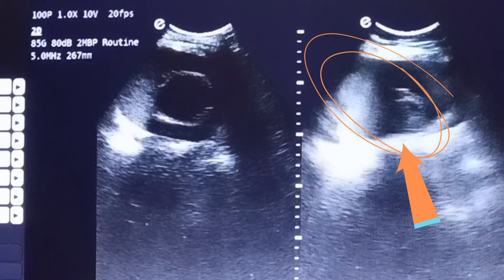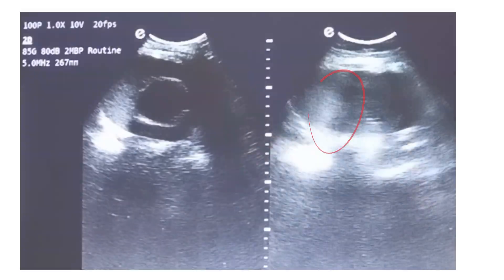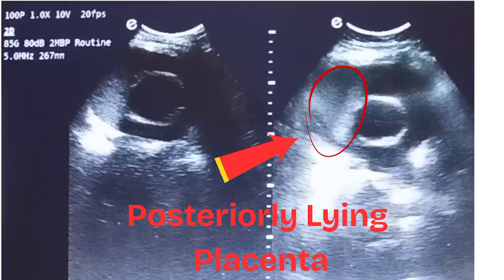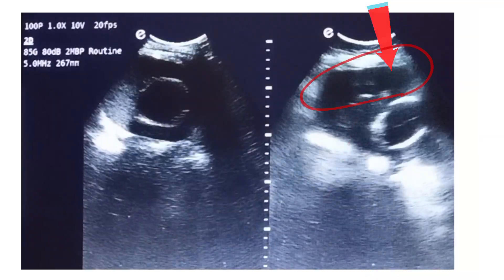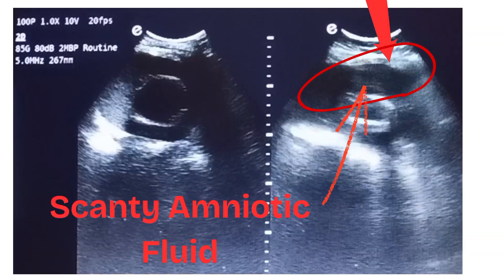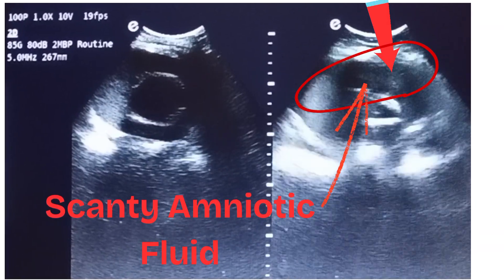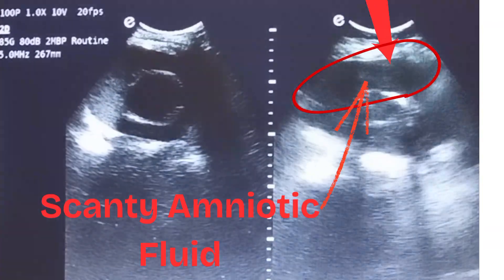Fetal chest can be seen inside the oval lines. The placenta is posteriorly lying, as seen here in the ultrasound inside the circle. Decreased liquor or amniotic fluid can be seen where the arrows are pointing to the black area.